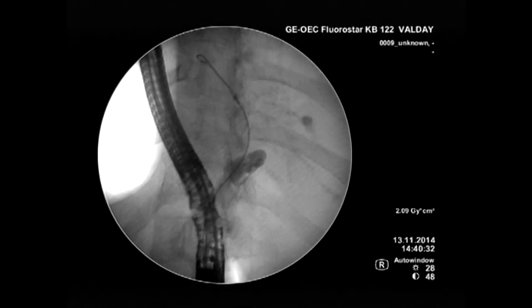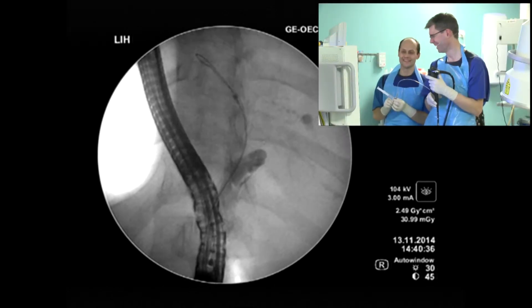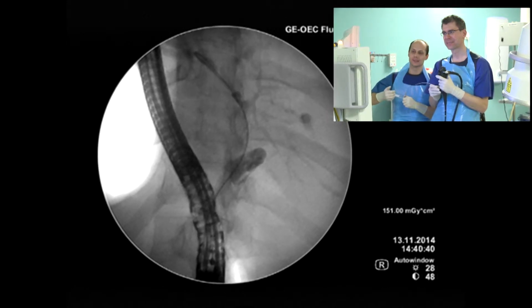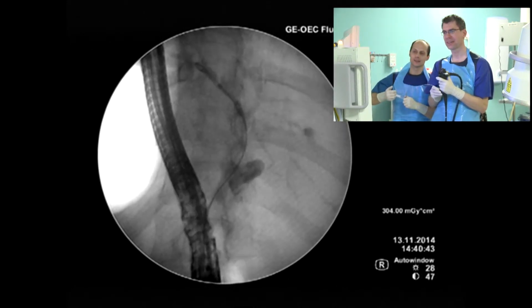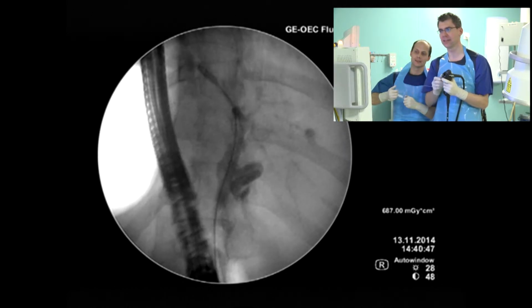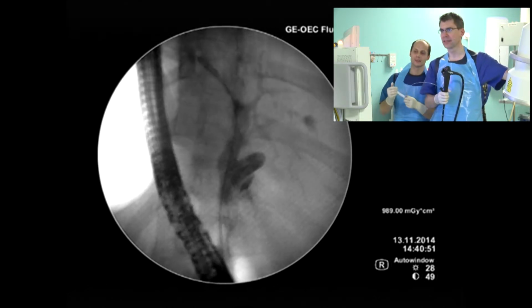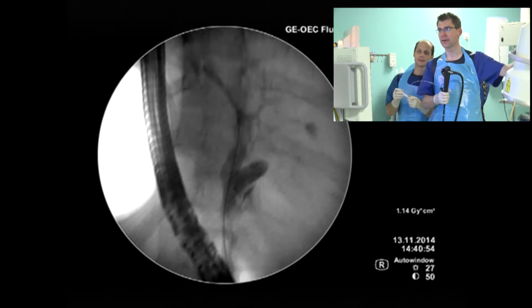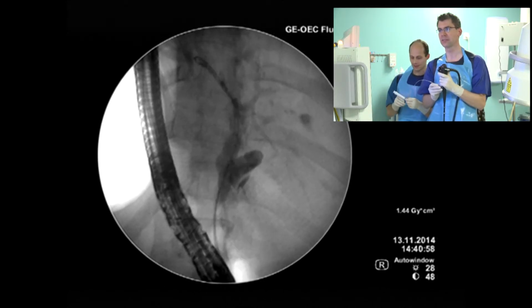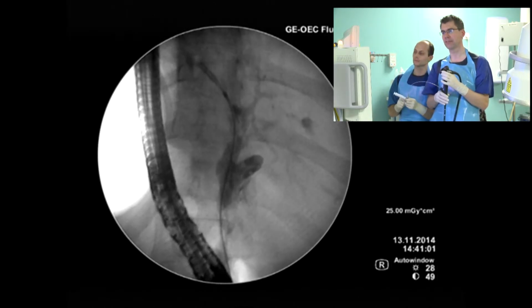Okay. So, we've been working together for many years, as you see. Yeah, it's true. Good. Inject contrast, please. Yes, please. Okay. And I've got rather large difficulties advancing the catheter here. What we see is that there are a lot of peripheral ducts there, but the left hepatic duct seems to be somewhat narrowed, which is a sign of inflammation in itself.